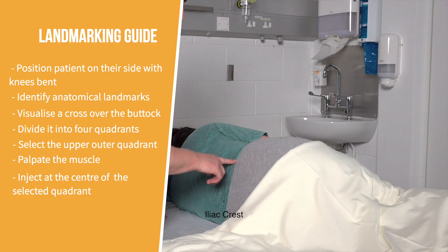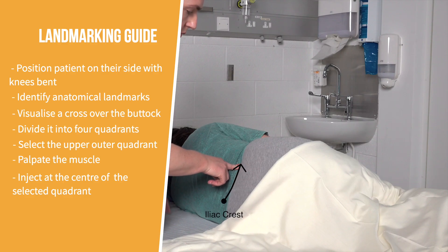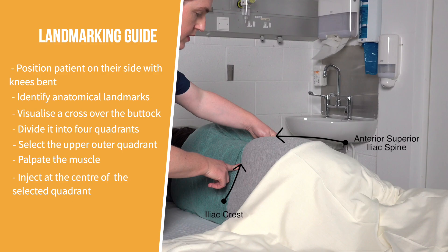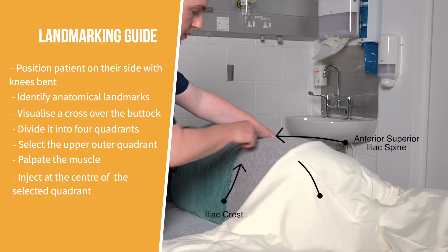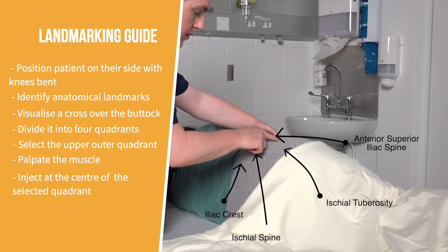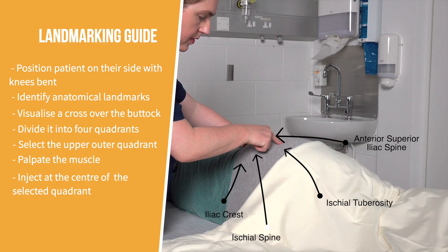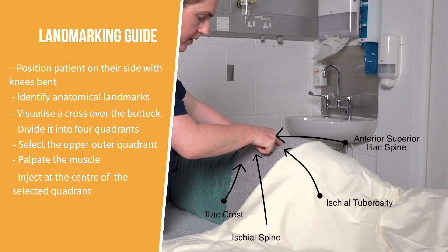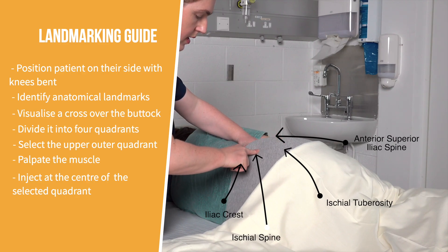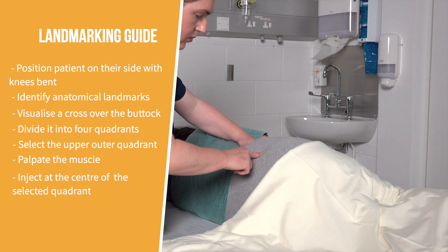Identify the following key landmarks: the iliac crest, the anterior superior iliac spine, the ischial tuberosity, and the ischial spine. Mentally draw across the buttock to divide it into four quadrants. The upper outer quadrant is the safe zone for intramuscular injection.